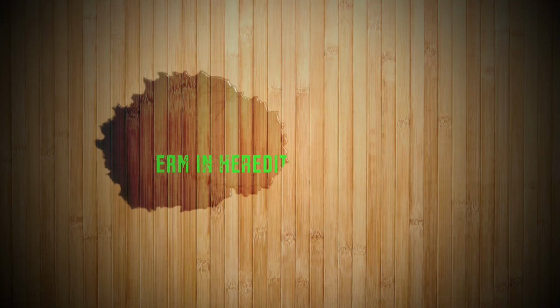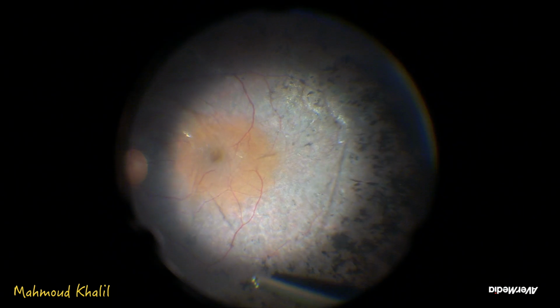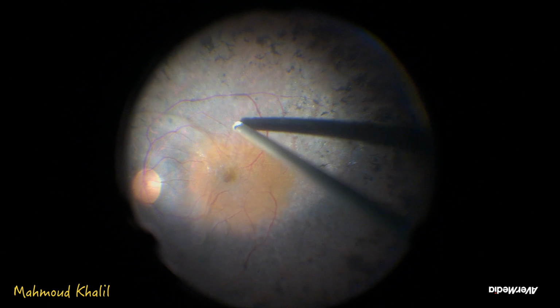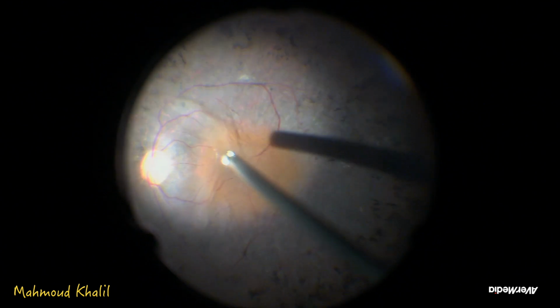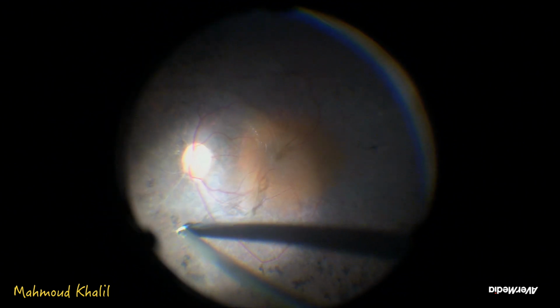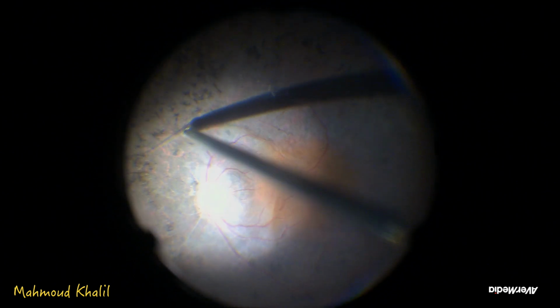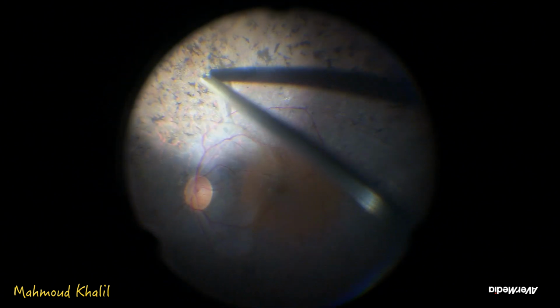The third video is an epiretinal membrane in one of the hereditary retinal disorders. This patient, as we see, has retinitis pigmentosa. These cases have very tight posterior hyaloid, very tight epiretinal membrane, and also very taut ILM. So when removing the posterior hyaloid, we have to remove it cautiously because it is strongly attached, and in eyes with a peripheral thin retina with scars, it may lead to iatrogenic retinal breaks.